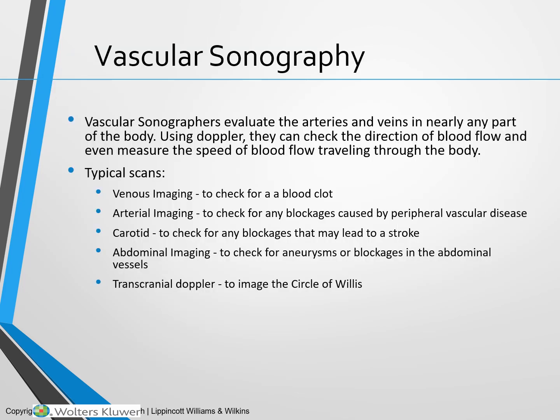A vascular sonographer or vascular technologist will evaluate the arteries and veins in nearly any part of the body. Using Doppler, they can check the direction of blood flow and even measure the speed of blood flow traveling through the body. They can look for blockages or anything abnormal with the blood vessels. Typical scans for a vascular sonographer would be venous imaging, arterial imaging, carotid imaging, abdominal imaging, and transcranial Doppler.